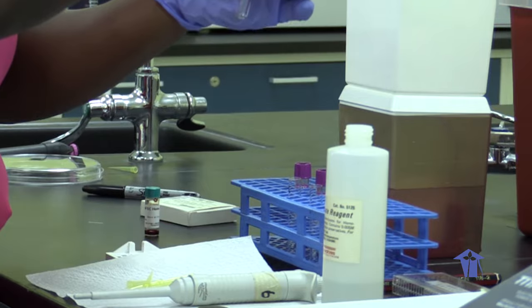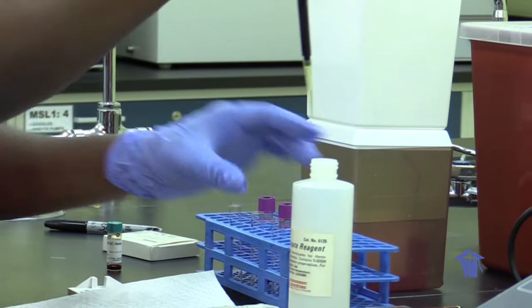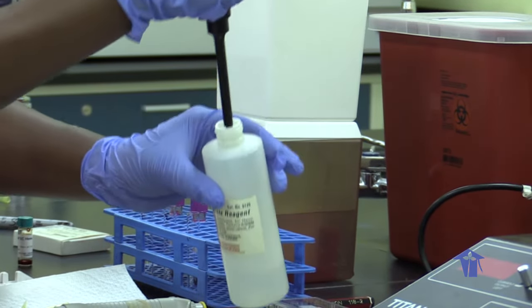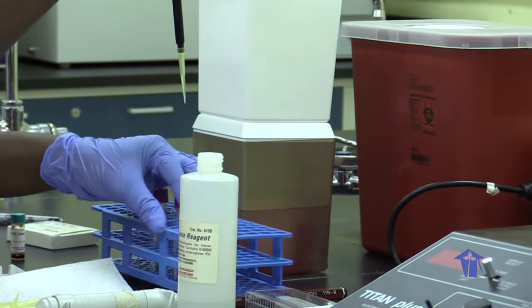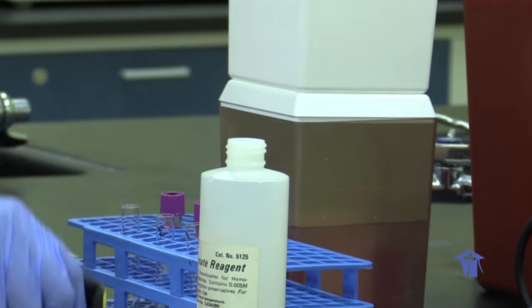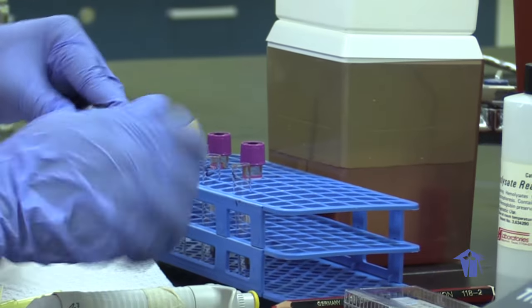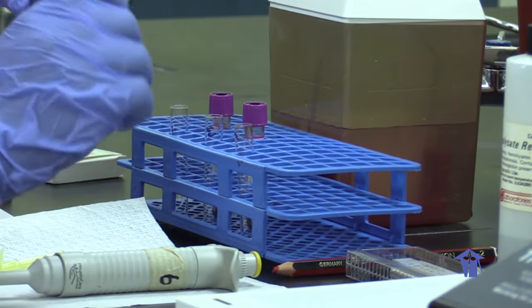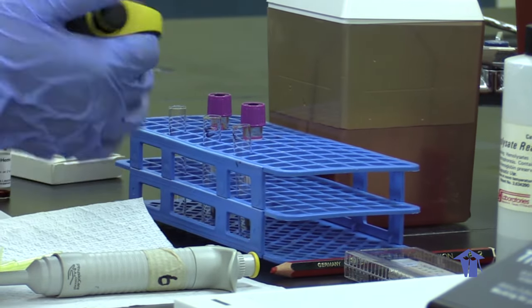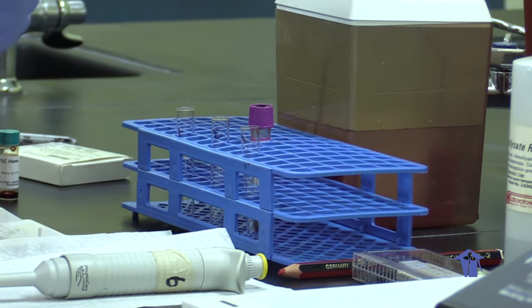So we transfer the hemolysate reagent to our tubes, 75 microliters. And we use our 25 microliters of the blood sample. So 1 part blood to 3 parts hemolysate. So we'll mix.